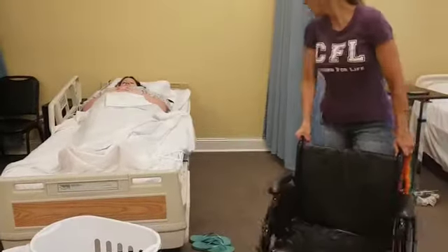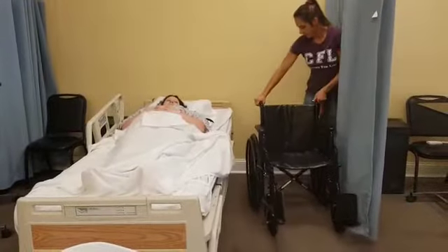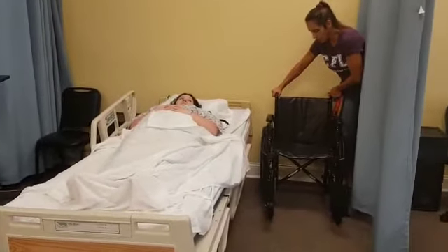Hey, Ms. Taylor, it's Tanya. We're going to get you up in the wheelchair for a little bit, okay? All right, so we put it up at the head of the bed.